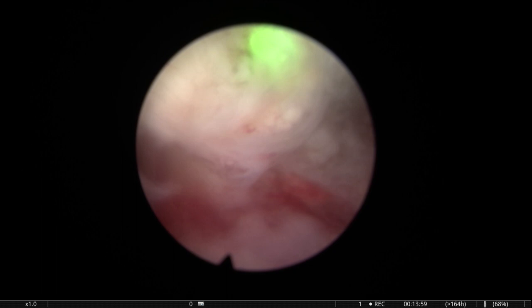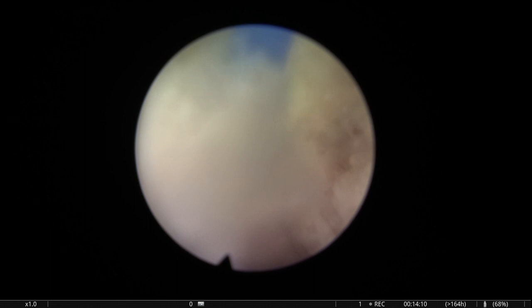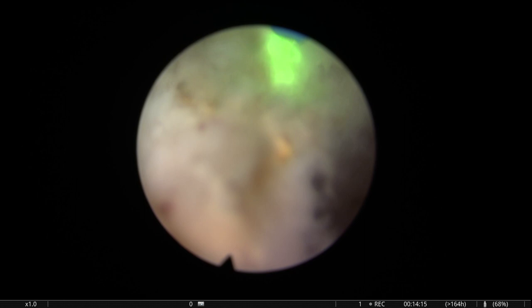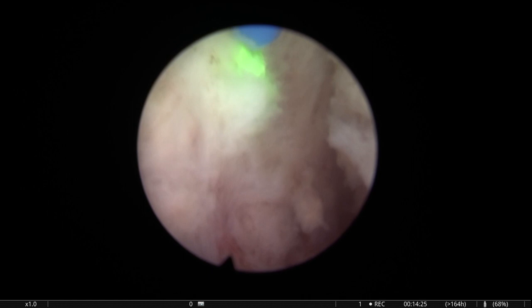Now you can see there's some surgeons like Cesare Scofone who defend this low power, thinking that the low power is going to cause less thermal damage to the capsule and the tolerance of patients is better. I think this is just a thought. I think there's no clear data that demonstrates that yet.